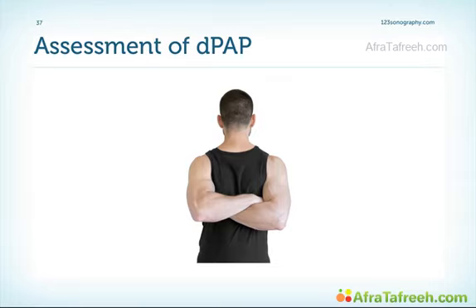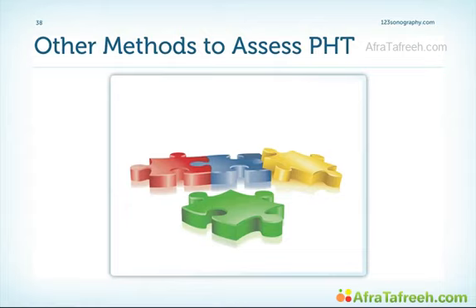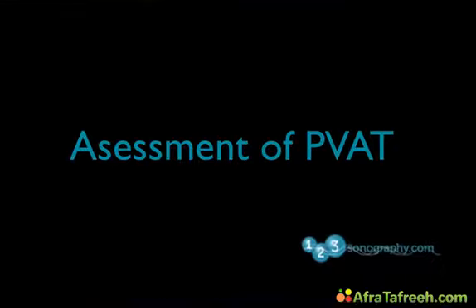The same applies to the assessment of diastolic pulmonary arterial pressure. Well, you can find the formula in your fact sheet, but don't make things too complicated and get twisted in your examination. What is more important than fiddling around with calculating diastolic or mean pulmonary arterial pressure is getting the full picture of pulmonary hypertension. So, let's look for other signs. One of those is pulmonary acceleration time, and Thomas is going to show us in a demo how to acquire an appropriate signal.